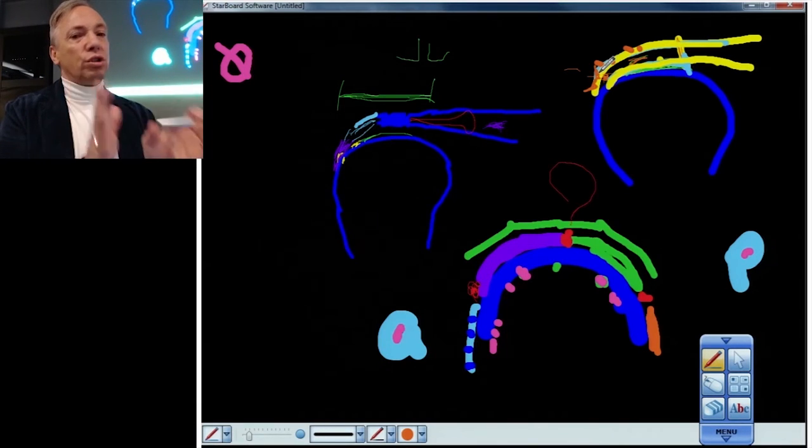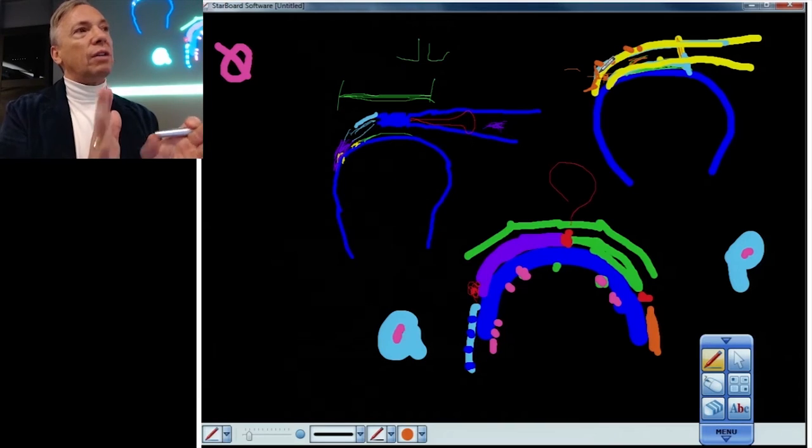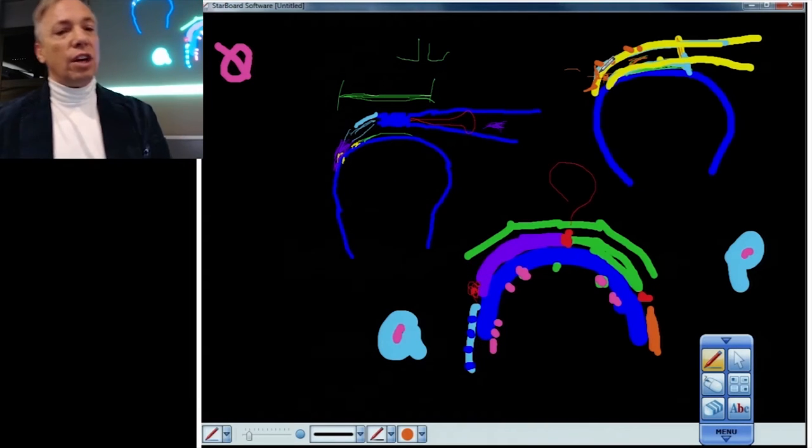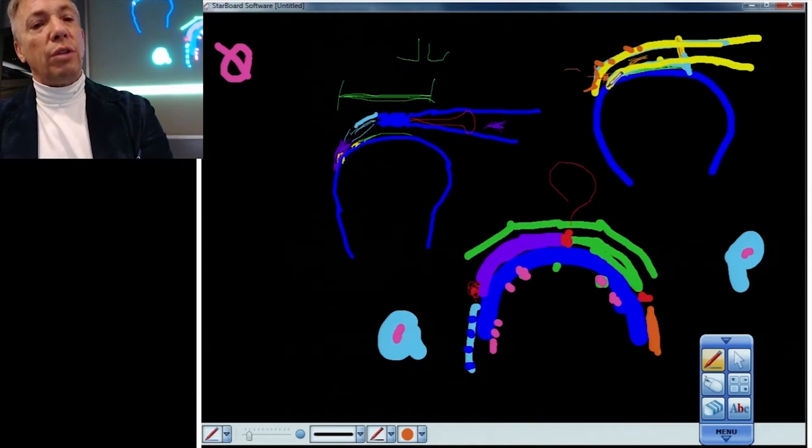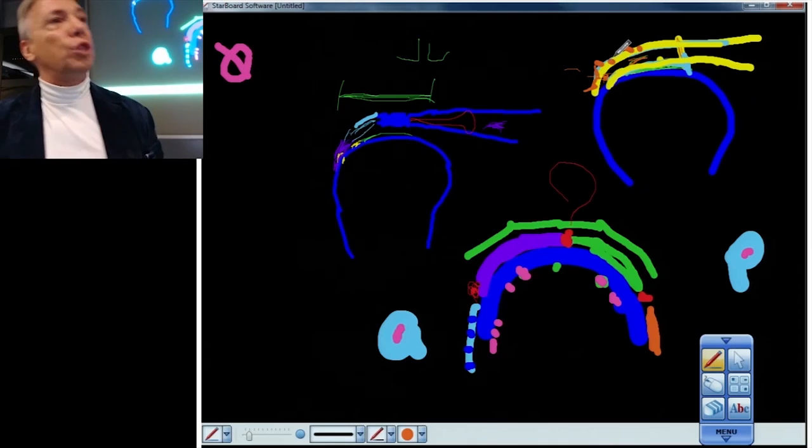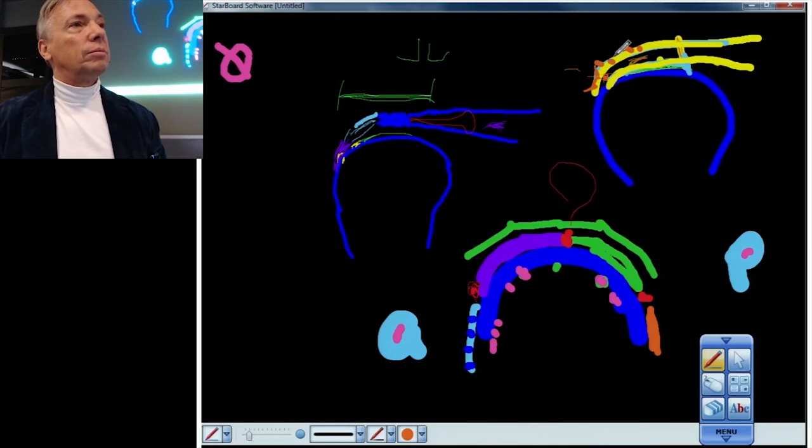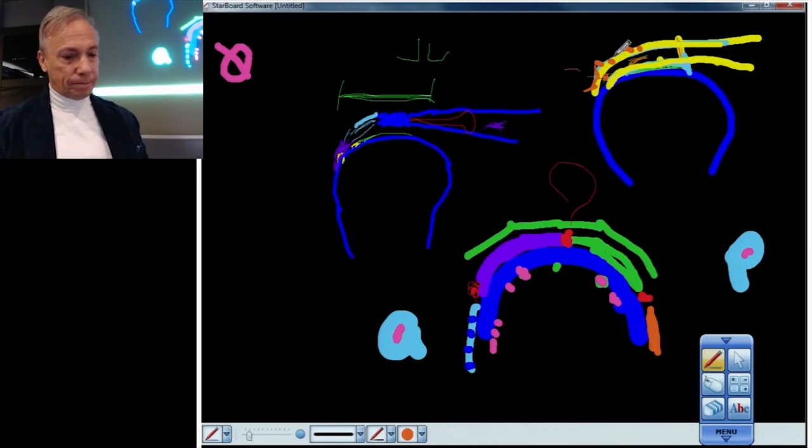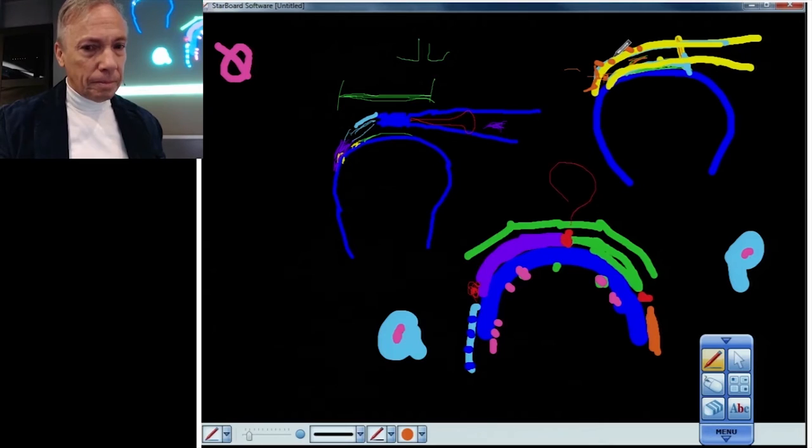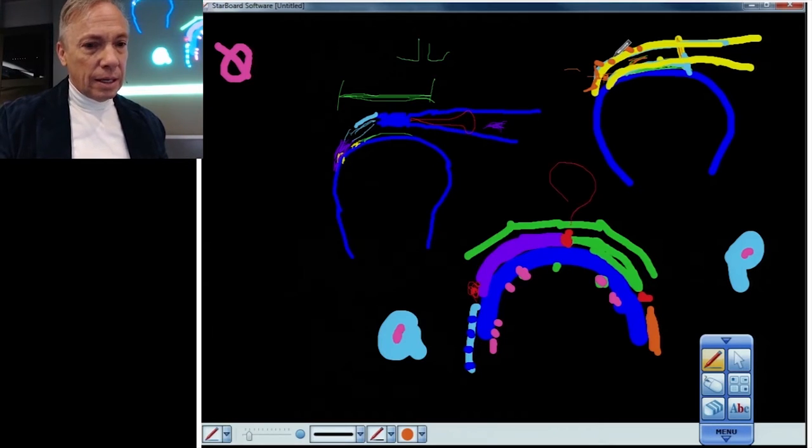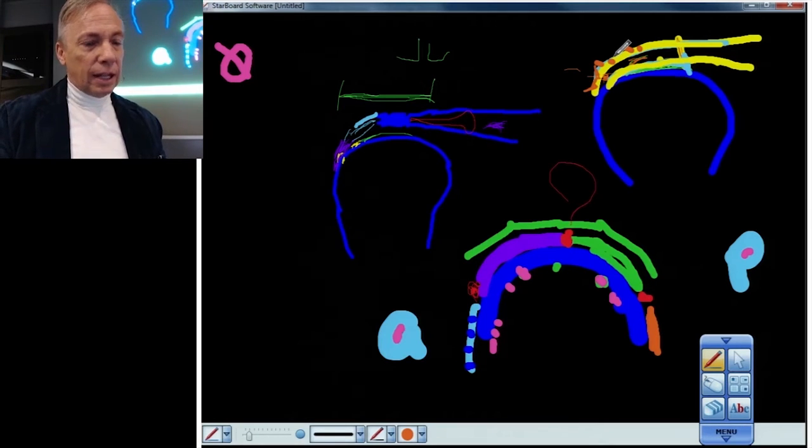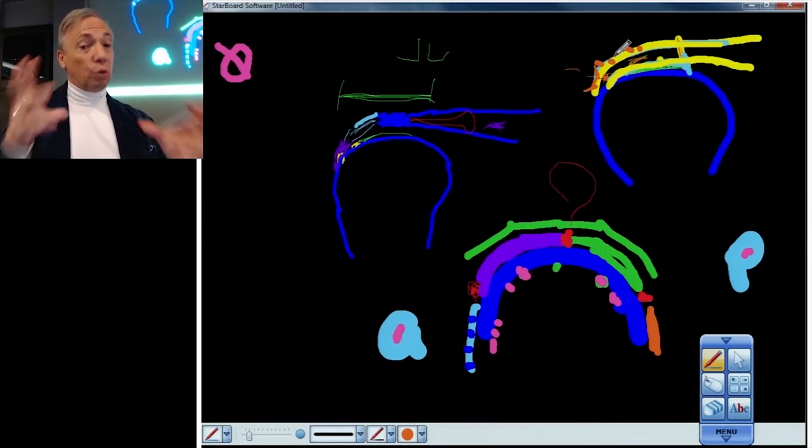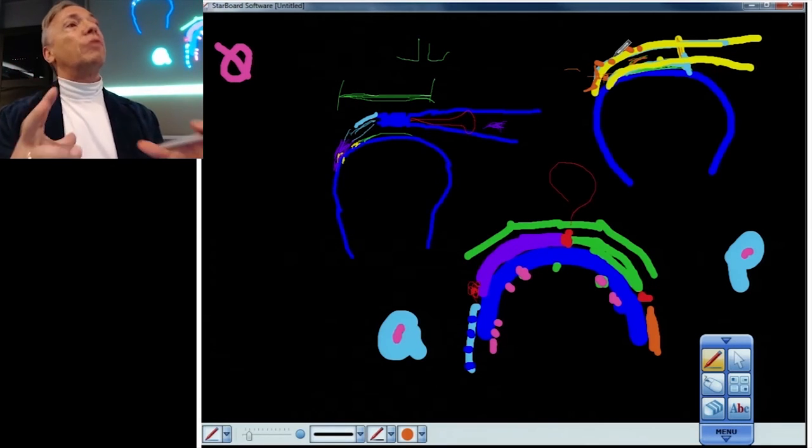And that is called the gullwing sign. Some people say the bird sign, some people say the W sign. But when you see that shape, especially if you don't have high resolution, you know that you have a unique bursal sided tear that is probably contained and doesn't go all the way through and allow fibers to retract.